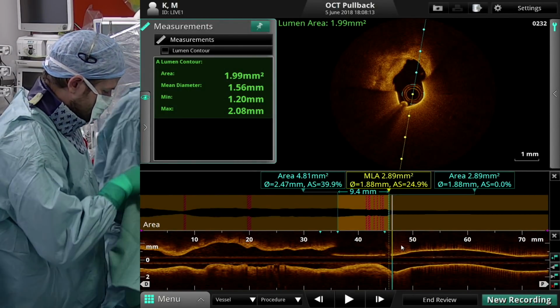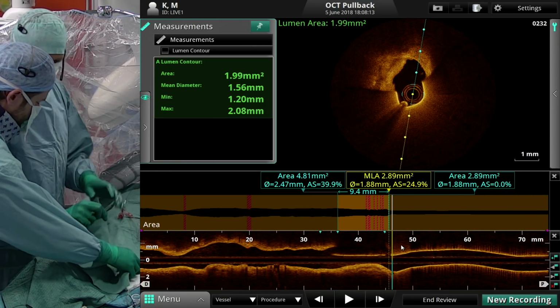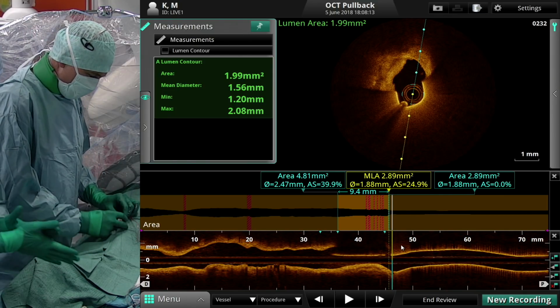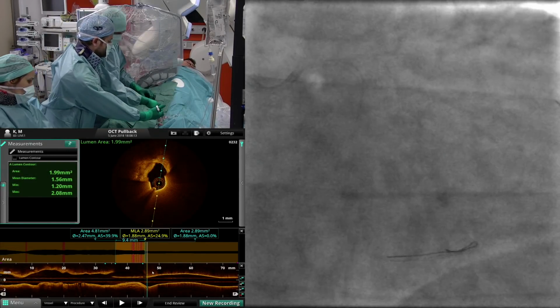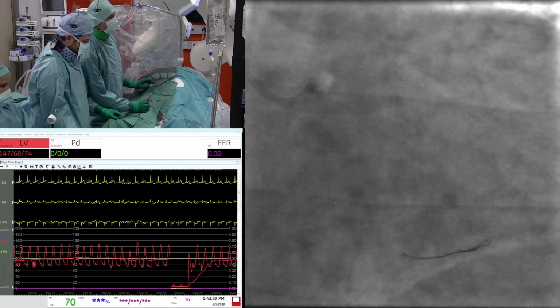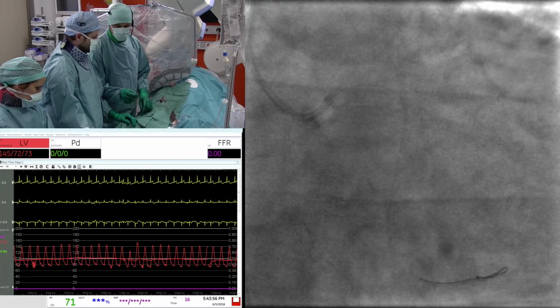Is it necessary to make pre-dilatation rather than direct stenting? I would say yes. I would always say yes, even if you have OCT guidance in this case, and you can be reassured by the quality of the tissue that you don't have a calcified ring. I think it is always good practice to prepare your plaque carefully in order to have an optimal stent implantation. That's my position.